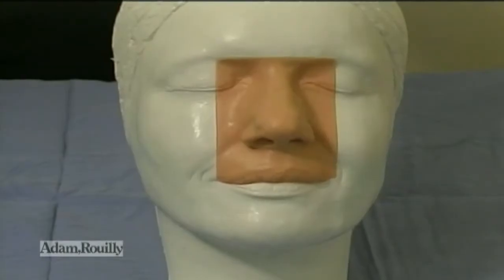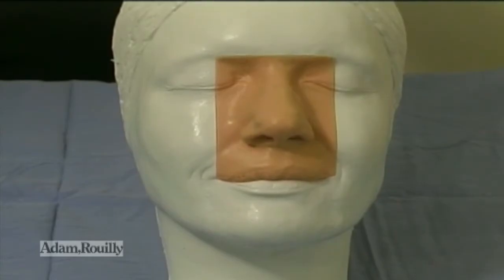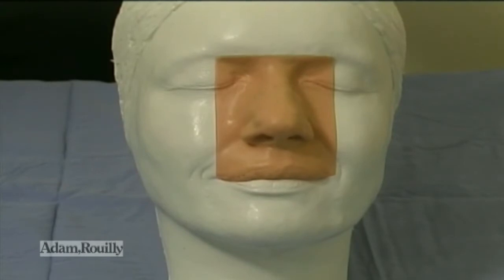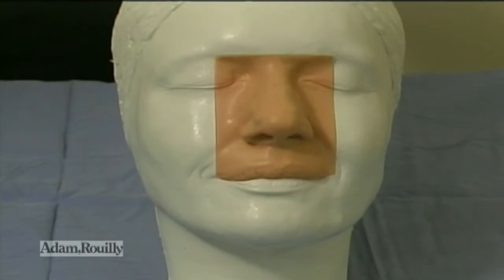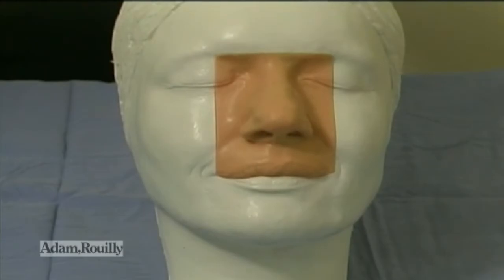Let's analyze this nose and discuss possible changes as we would with a patient. Typical proportions of a Caucasian female are examined here. On an anterior view, the nasal length from the radix to the tip defining points is a little long, one millimetre longer than the stomian to menton. There is a deviation of the tip to the right. The width of the bony base should be 75% to 80% of the intercanthal distance and is a little wide in this case.